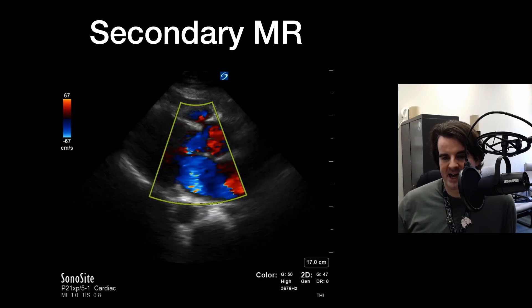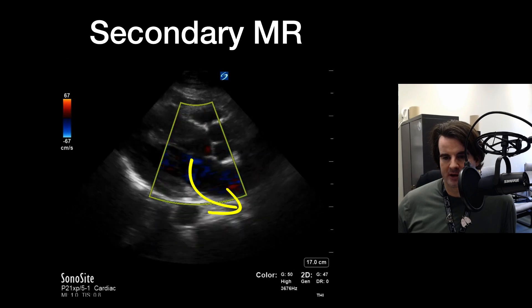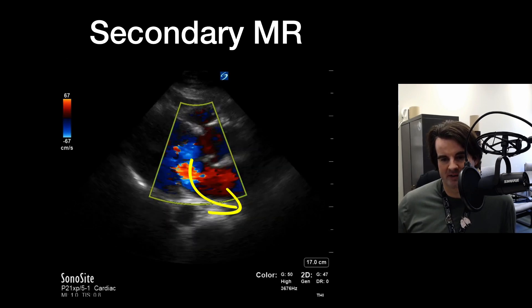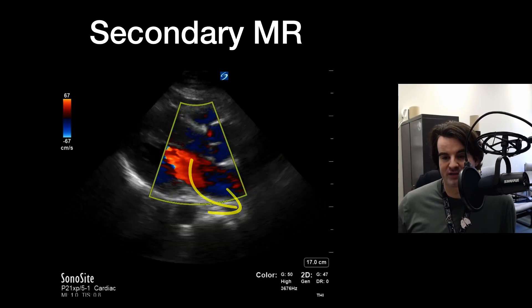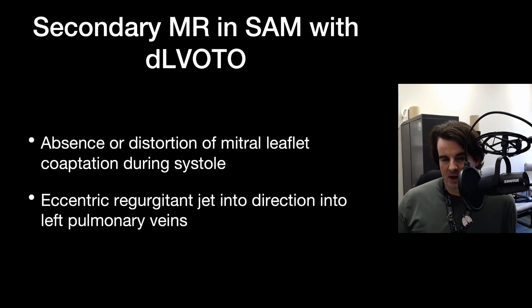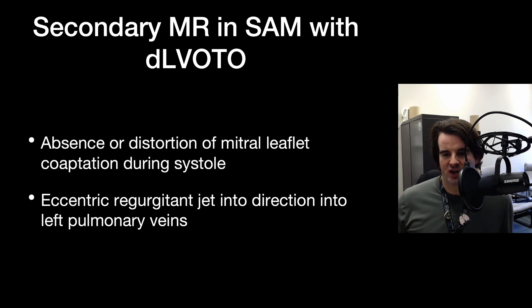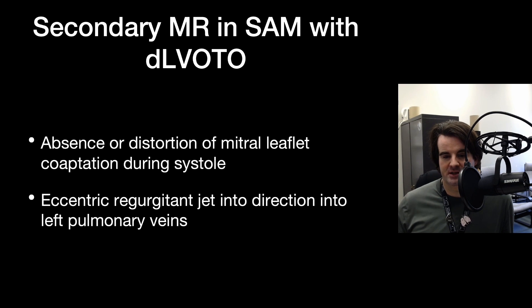On the parasternal long axis, we can see again that posteriorly directed jet, which here is quite generous. This patient actually did have severe MR with their dynamic obstruction. The reason this happens is an absence or distortion of mitral leaflet coaptation during systole — as that apparatus gets pulled away, the valve just can't coapt. This can lead to eccentric regurgitation into the actual left pulmonary veins as well.